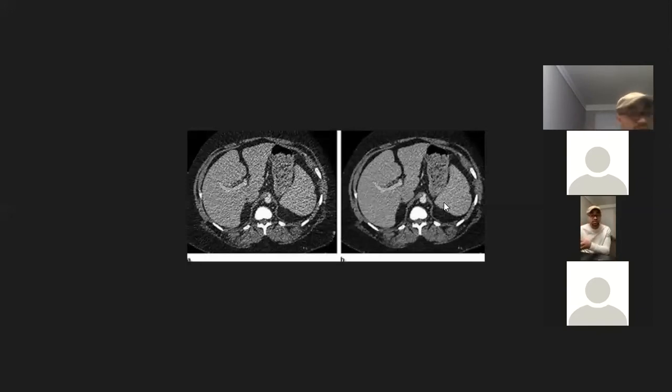More photons equals more signal. More signal means a clearer image, or a higher contrast resolution, because we're getting more information. You could think of the photons as literally more information, right? Because they pass through the person, some are attenuated, and the more that pass through, the more data those detectors are getting about what was scanned. More photons mean more signal or more information. That's how you need to think of that, okay? Are we good there?